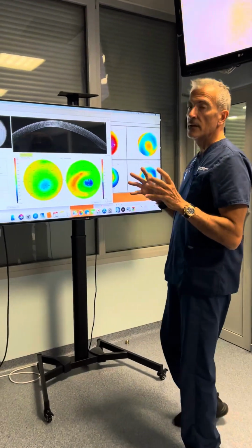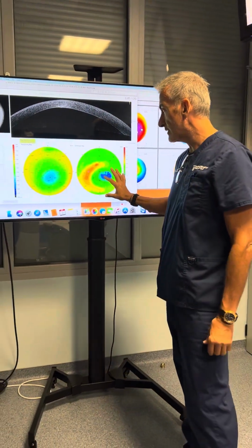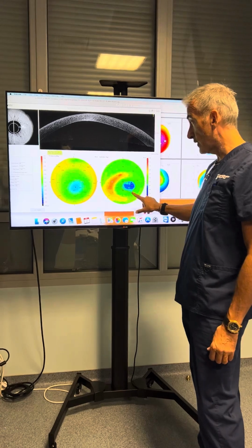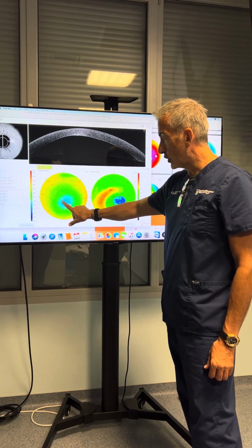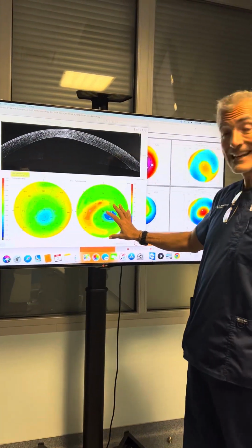So it's a myth that over 50 keratoconus does not change, because despite the fact that this patient is not a rigid gas permeable contact lens wearer, which would explain this epithelial remodeling, we can see on the total OCT, anterior segment OCT thickness map, that the cone is clearly evident. And we can see on the epithelial maps that it's an active cone.